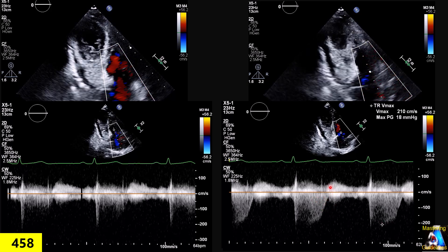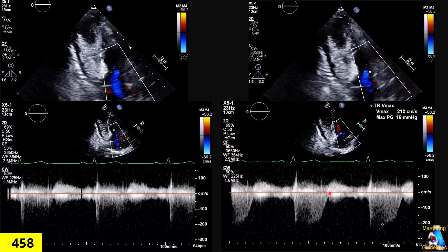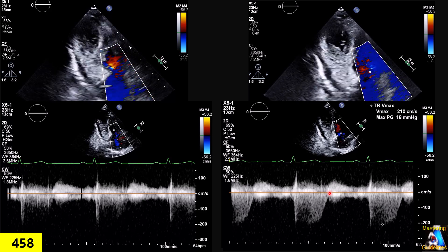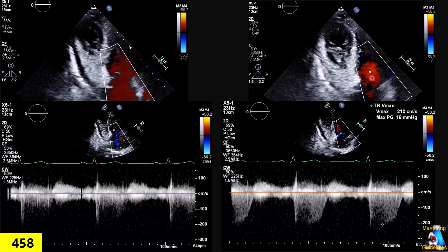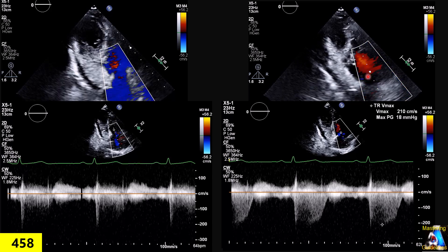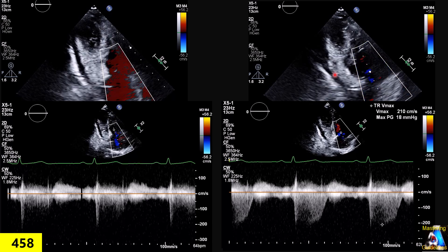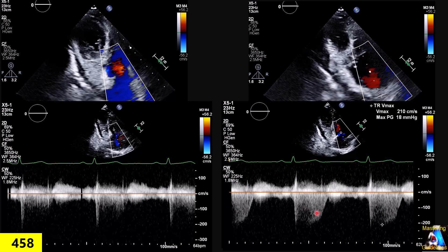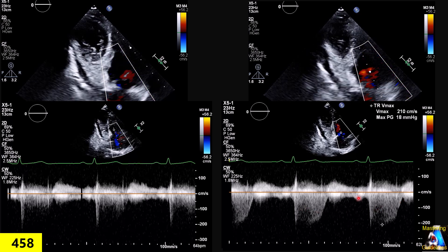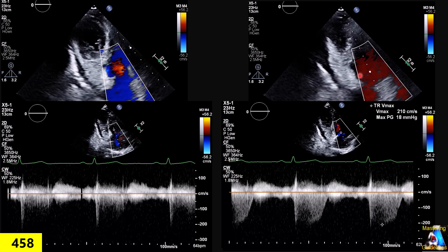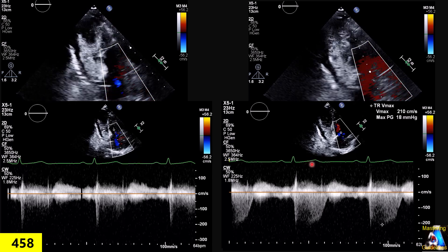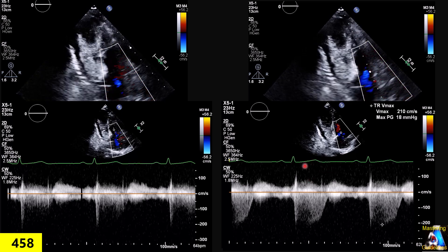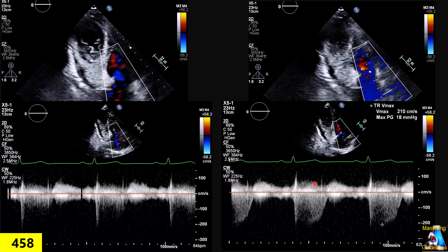That is good practice whenever you use continuous wave, especially on the aorta, tricuspid, or any valve where you want to capture a jet and don't have a strong signal. In continuous wave, if you put the sample volume at the area of interest, it gives you a better envelope and spectral Doppler for the continuous wave Doppler. So the sample volume in continuous wave acts as a focus point or focal point — always practice this, as it will help you capture those weak Doppler signals.